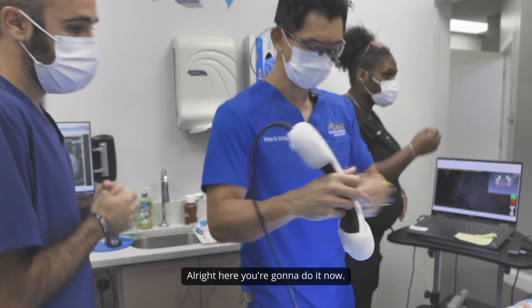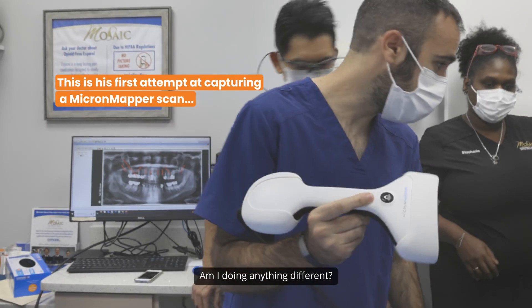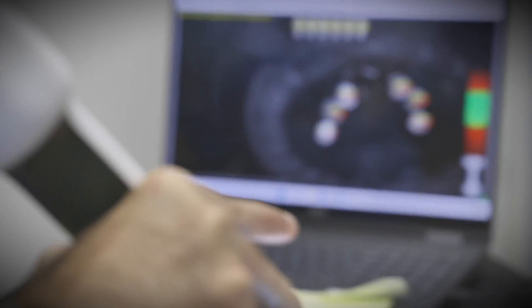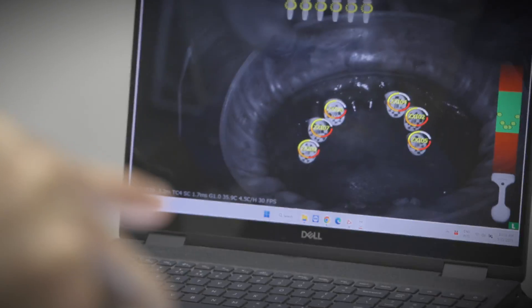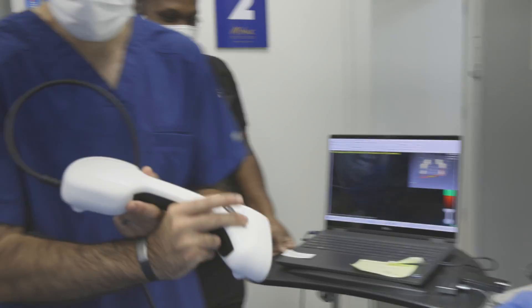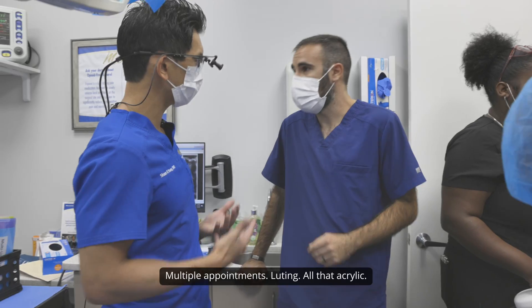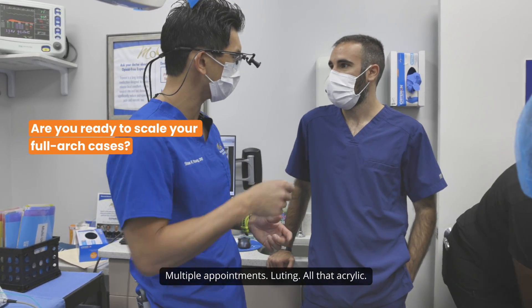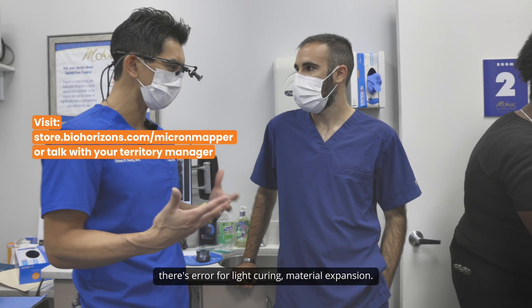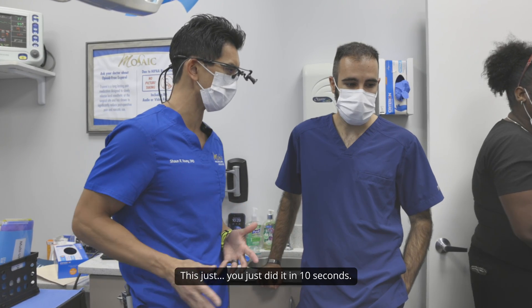All right, you're going to do it now — just do exactly what I just did. You got it on faster than I did! This literally replaces a jig verification — multiple appointments, all that acrylic, picking up the cylinders, curing it. There's error from curing and material expansion. You just did it in 10 seconds. It's done.